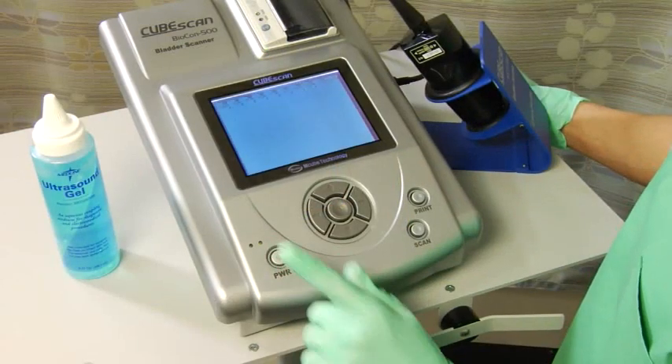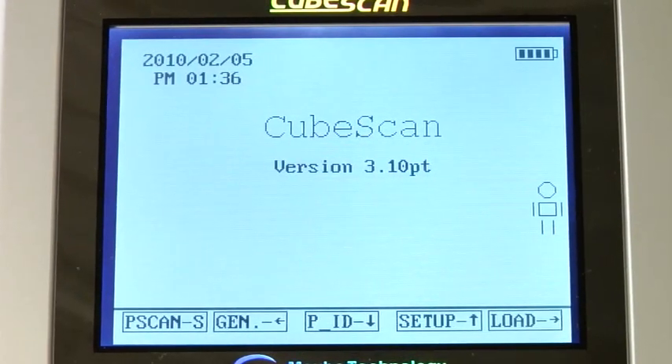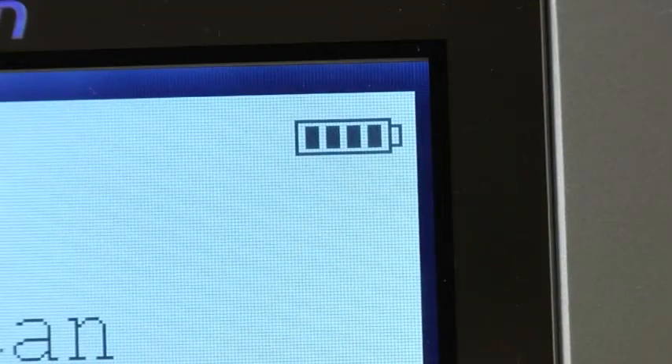The Biocon 500 has a very easy-to-use interface. It's lightweight and simple to move from room to room, and runs on a rechargeable battery.